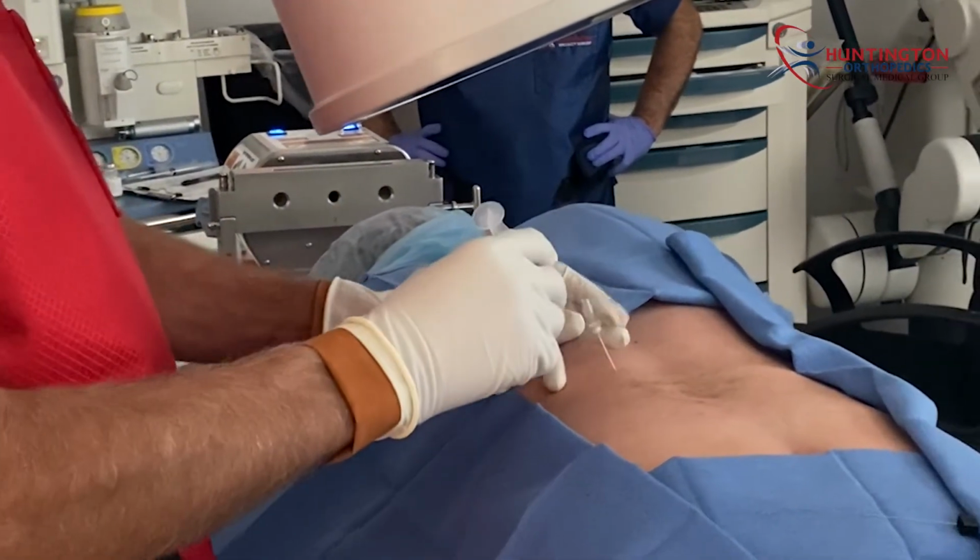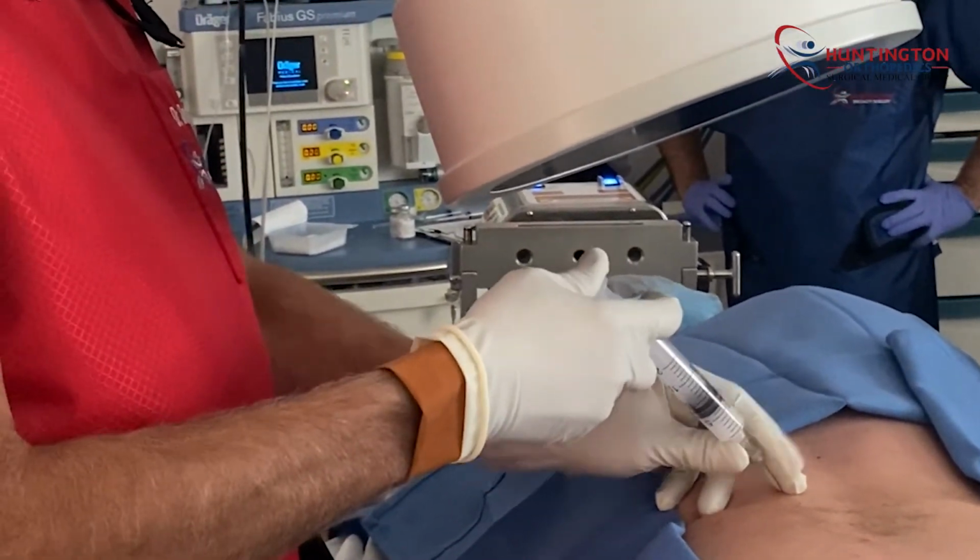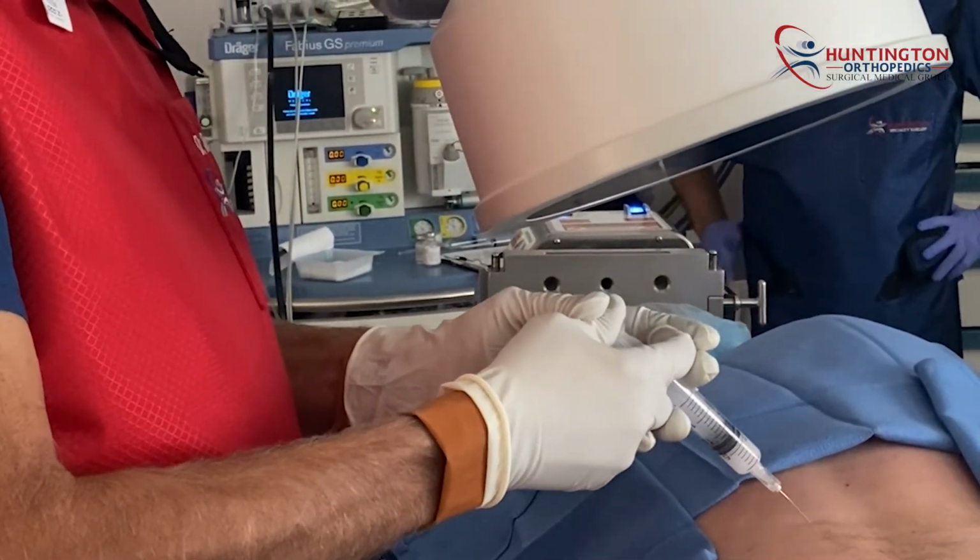And finally, the last thing that we do, sometimes akin to a sacroiliac joint injection, is our medial branch blocks, or facet injections as some people know them. In a similar fashion, we identify them by using the fluoroscope in an oblique position, and then put a needle directly into the joint and give them a little medication there, confirmed with dye, and then in the area where the nerve goes to that joint.